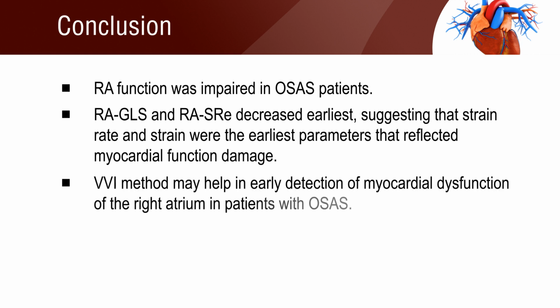Velocity vector imaging method may help in early detection of myocardial dysfunction of the right atrium in patients with obstructive sleep apnea syndrome.